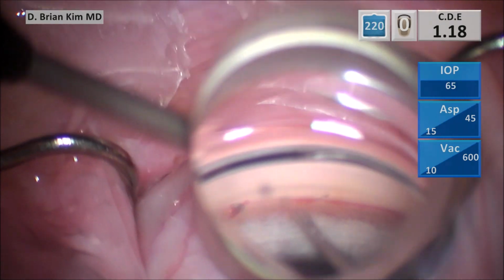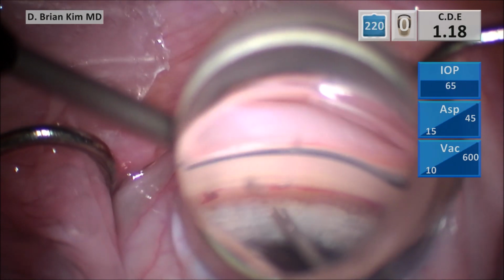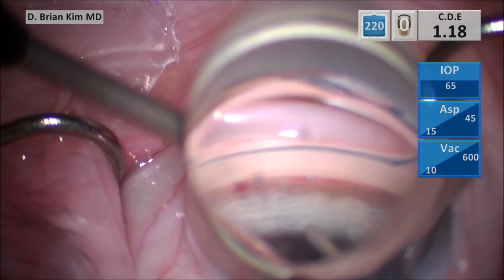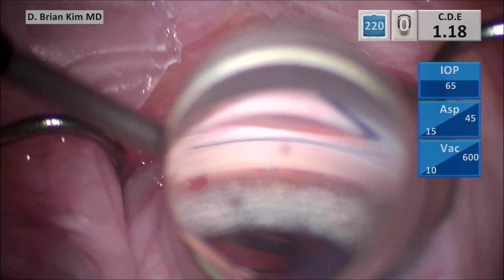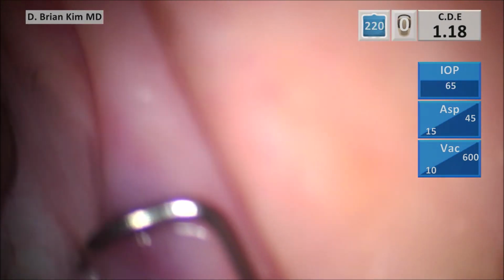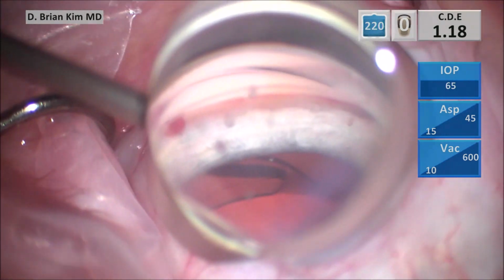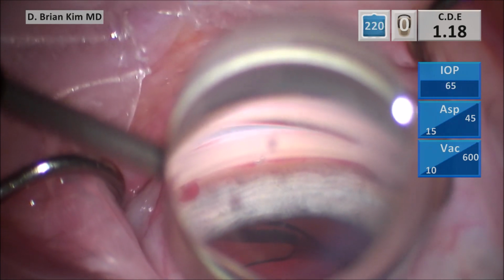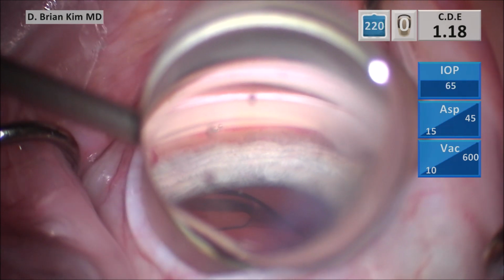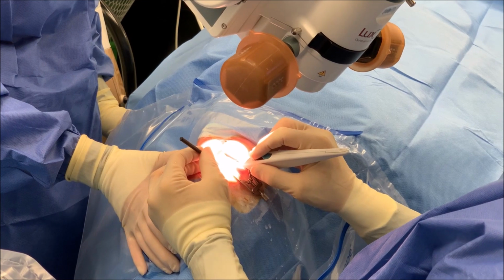So just as an exercise, I'm trying to rotate myself in order to place the second stent without coming out. And you can see here, I'm having quite a bit of trouble. And so my first pearl is go ahead and pull the sleeves down, remove the device, and rotate the microscope as well as your chair. And so that's what you're seeing me doing here. I'm rotating the microscope so it's pointed more towards the right, and then I'm turning my chair towards the left as well. And so I'm going to show you from an external point of view what I'm doing. So I'm going ahead and fire the first device.